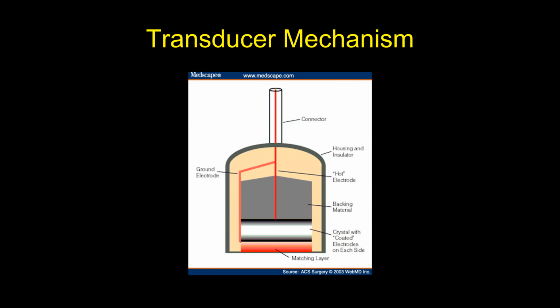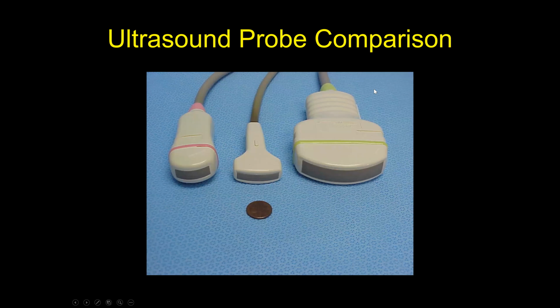So what's inside one of these probes? So here's our probe. You can see here's the cord. It would be a long cord that plugs into the machine. And here's the probe housing that you can see.